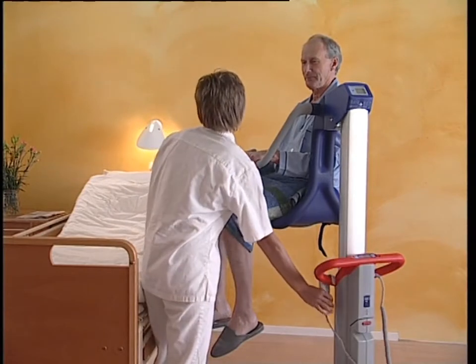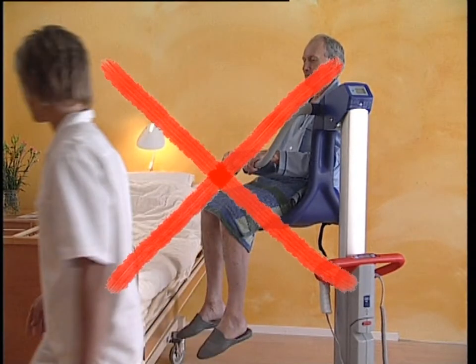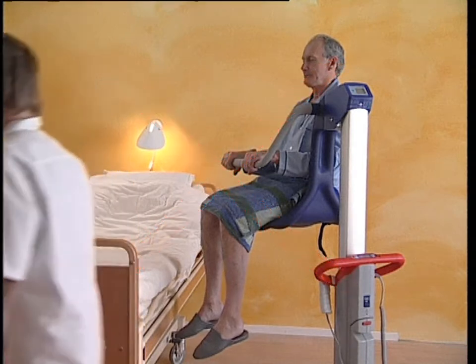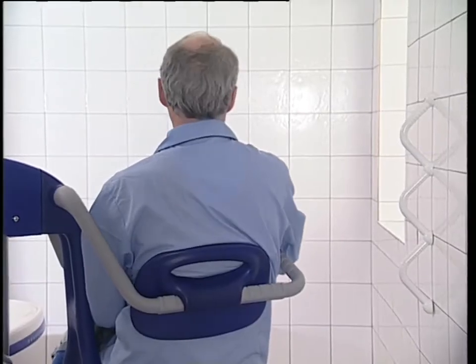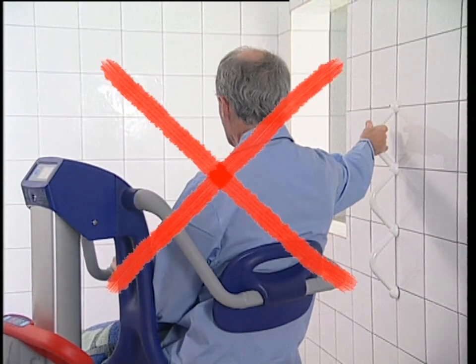Never leave the resident unattended at any time, particularly when the Alente is in a raised position. Ensure that the resident does not pull or hold onto stable objects such as grab rails, sinks, and other equipment at any time, particularly while the Alente is being moved or when the brakes are applied.